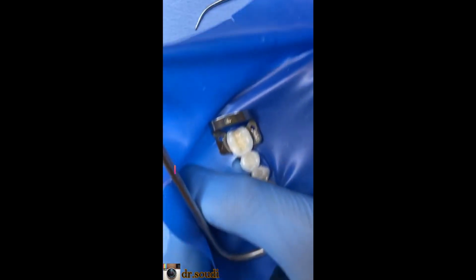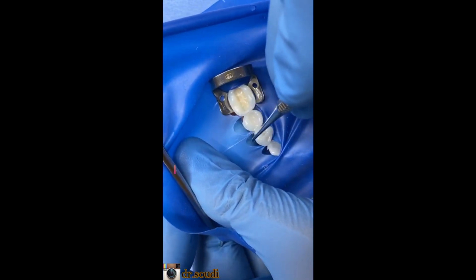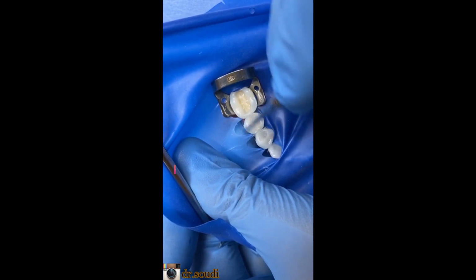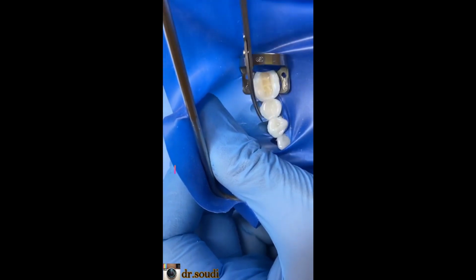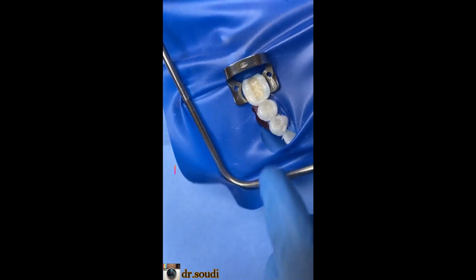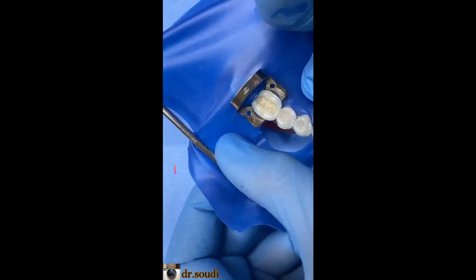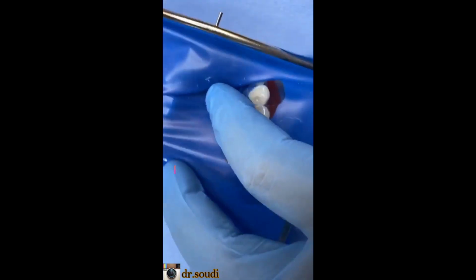You can see here, this is the septa. Septa means the part of rubber dam sheet between the two holes. For safe removal, cut the septa, these septa. Okay, like this. Cut this septa for safe removal. You don't need the patient's blood or plaque to be on your face. For the safe removal, then remove the clamp. Okay, this is for placement.